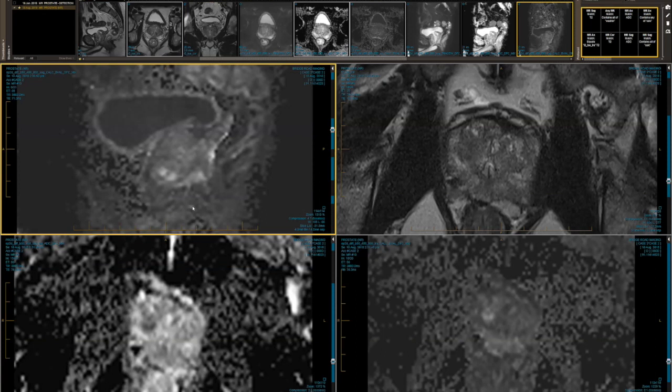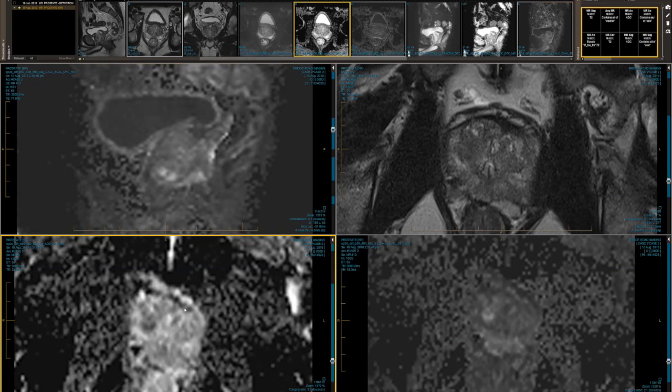and there's a sort of historical reason for that. I think the PIRADS version 2 is absolutely fabulous, and it's a lovely lexicon and primer to allow you to start to report prostate MRI. It gives you a really nice way to hang your visualization of the sequences and to work out a score as to how suspicious or not you think a prostate is.